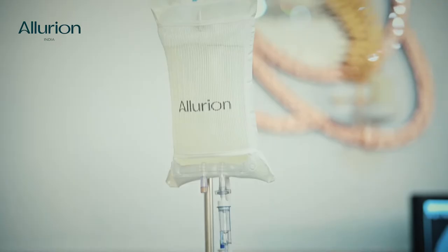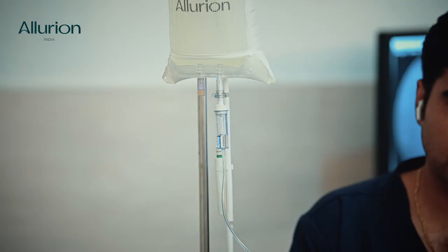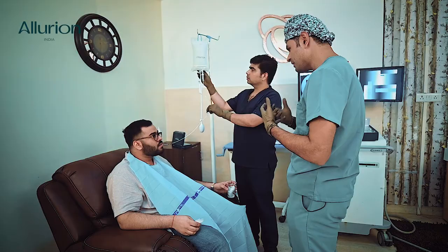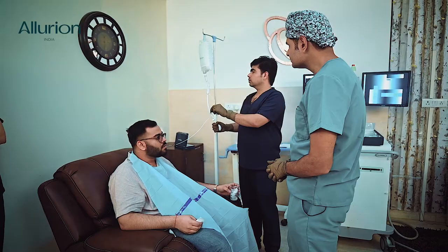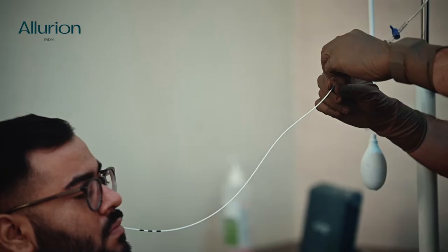We'll start the filling — you can see it will increase. If we feel the pressure is too much we can adjust. The capsule takes a little bit of time to dissolve, usual time is three to four minutes. You will feel as if chilled water is going through your esophagus — that's a very normal feeling. The more you take deep breaths the better, because deep breathing stimulates your parasympathetic system and the refluxes will go away. The fluid is now completely evacuated from the bag and we'll disconnect the source.